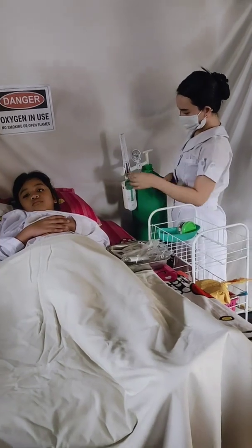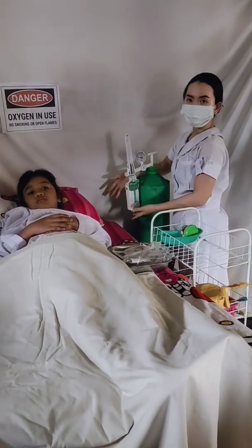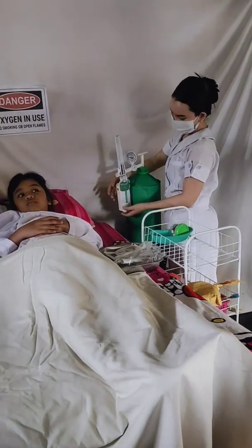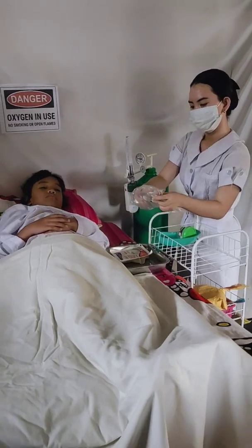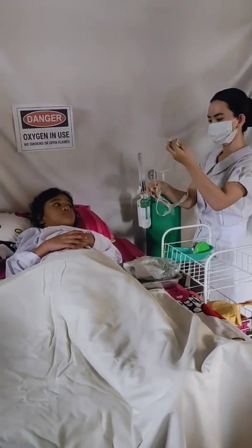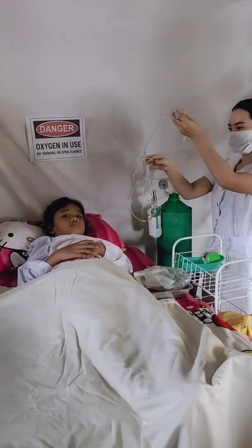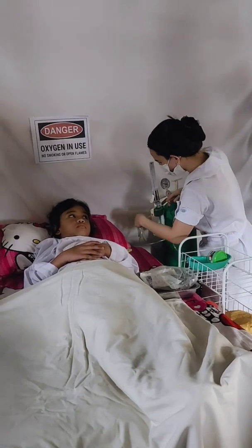For the implementation, first is set up the oxygen equipment and humidifier, then attach the flow meter to the oxygen tank. Note that the flow meter should be in the off position. If needed, fill the humidifier bottle. Attach the humidifier to the base of the flow meter. Attach the prescribed oxygen tubing and delivery device to the humidifier.